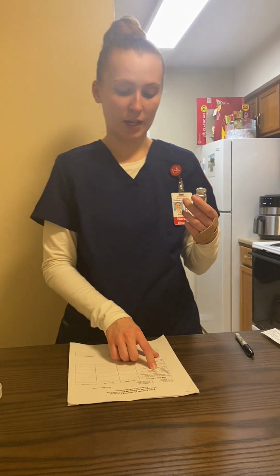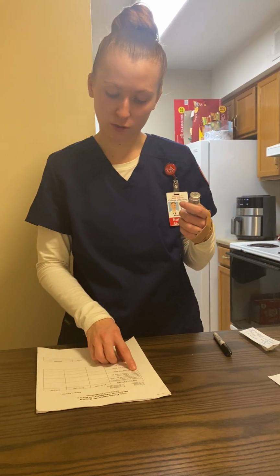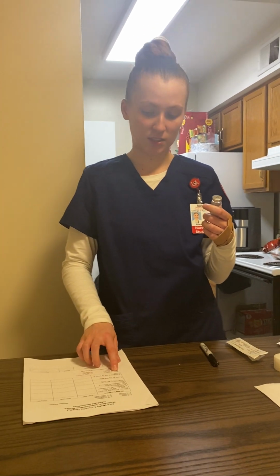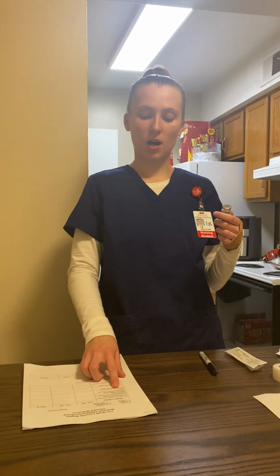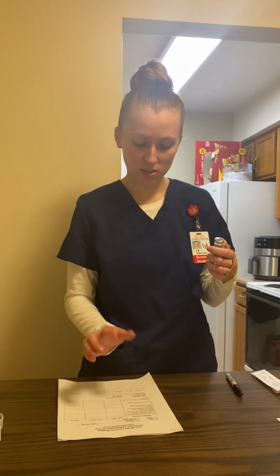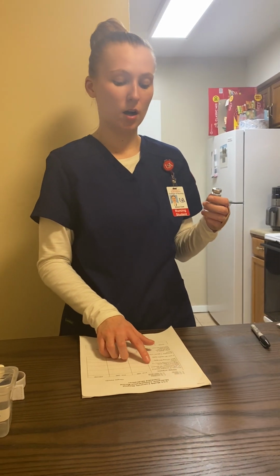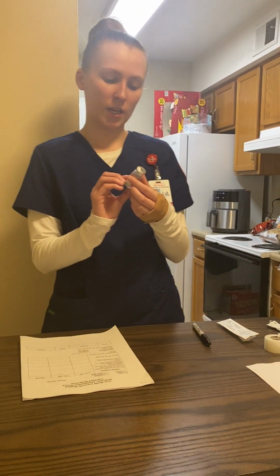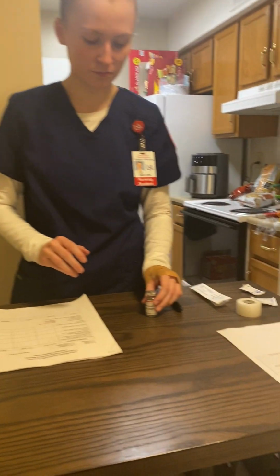So we'll be using a tuberculin syringe. This medication is to be given every 12 hours. Mr. Jones has not received heparin within the past 12 hours, so he is due for another dose. Heparin is an anticoagulant, meaning it protects him from blood clots, and this order has all of the elements for a legal order. Looking at the vial, the expiration date is 12/5/25, so it is not expired and it is okay to use.